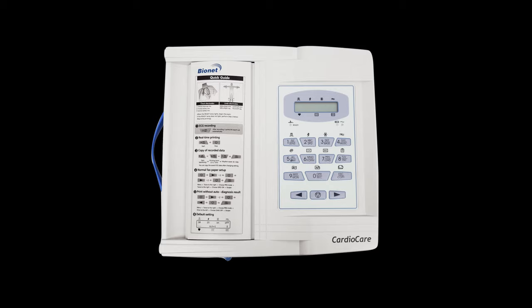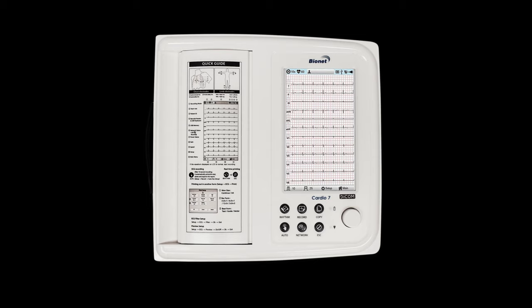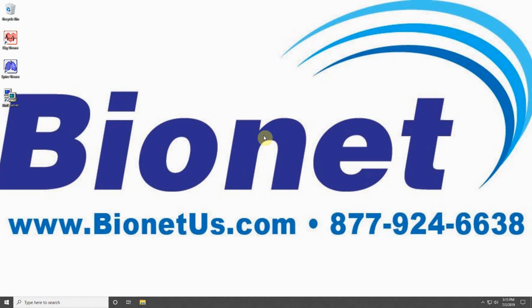BMS Plus connects to the following machines: the CardioCare 2000, Cardio7, and SpyroCare. For all of these machines, you will need to first obtain your computer's IP address.